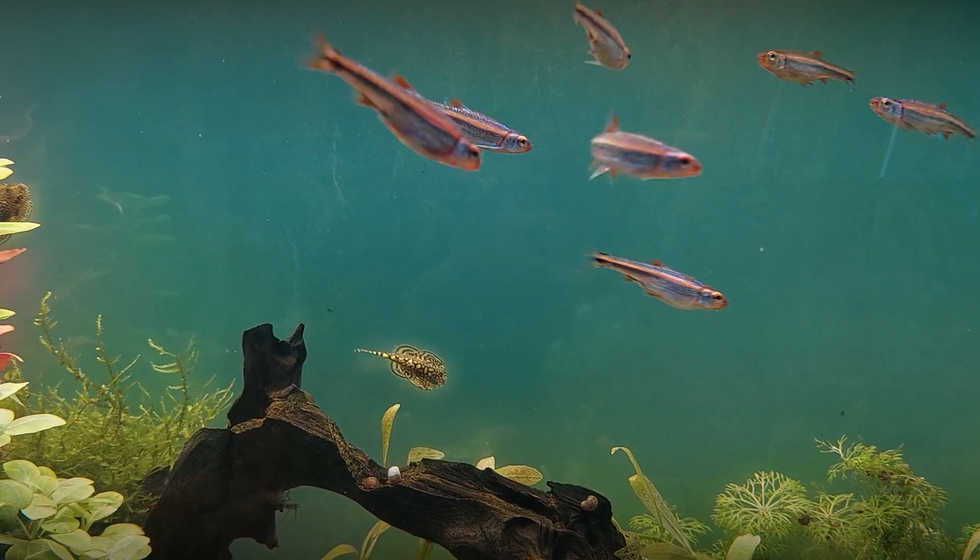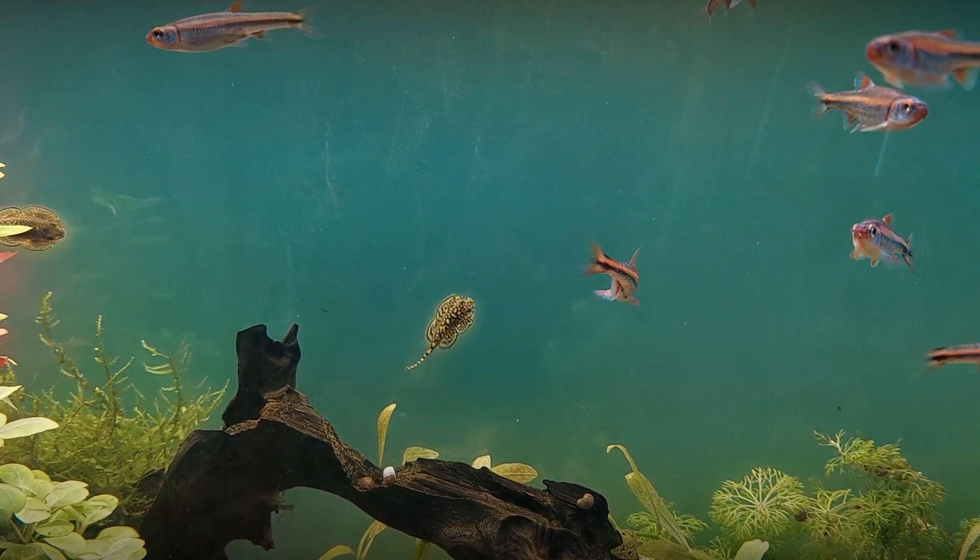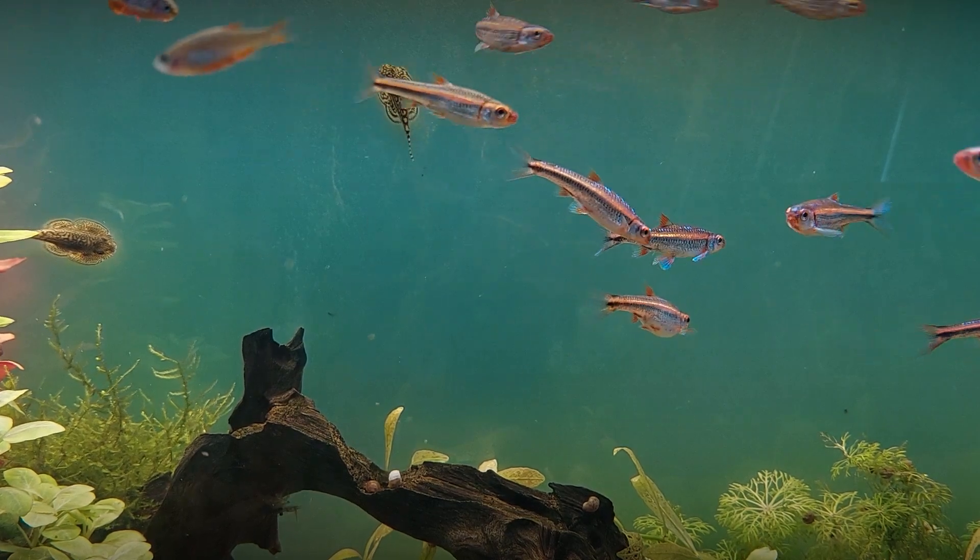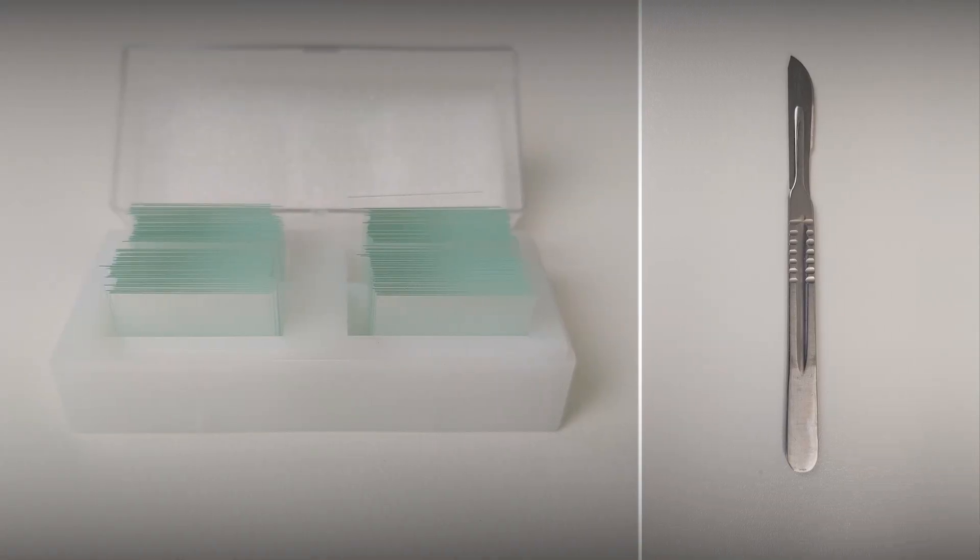Depending on the size and species of fish, the procedure is slightly different. For small aquarium fish, we can do a skin scraping with a cover glass or scalpel, to create a slide for microscopic examination.